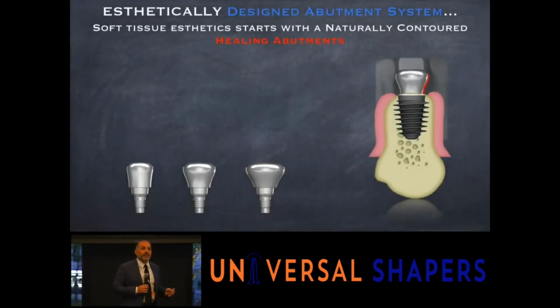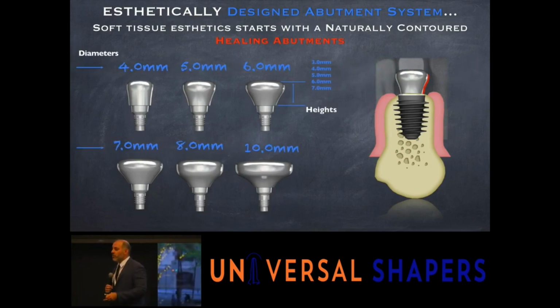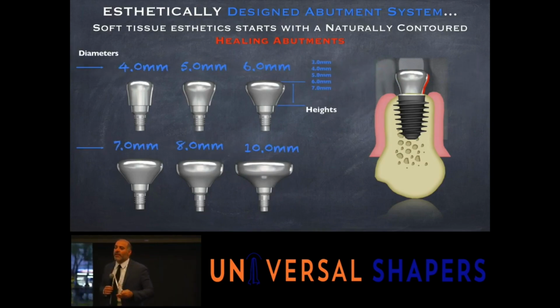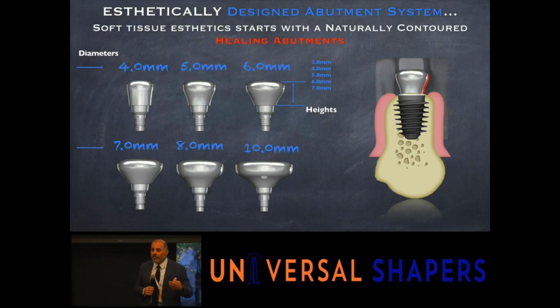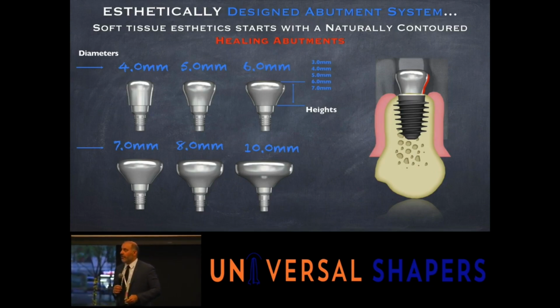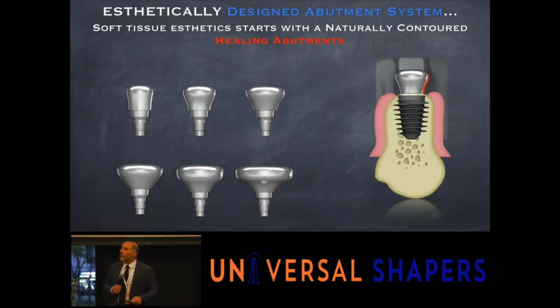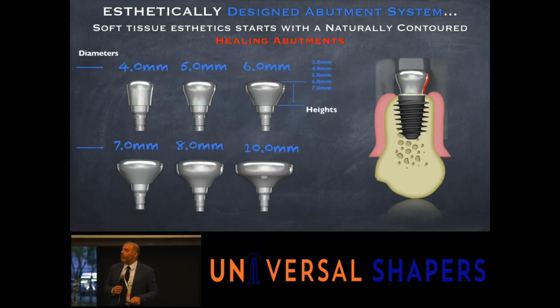So using aesthetically designed healing abutments, like the ones I'm showing you here from the Megagen system, which we'll have today to use. You can see that S-line built in, especially as you go to the wider type of healing abutments. And the wider healing abutments will certainly help you in lots of ways that we'll discuss a little bit later on today. Also, the variability of heights, not just widths from 4 to 10 millimeters wide, but also the available heights, going up to 7 millimeters tall.